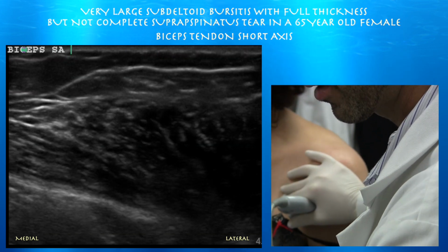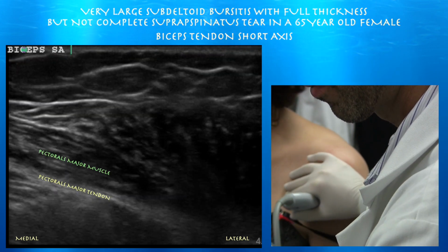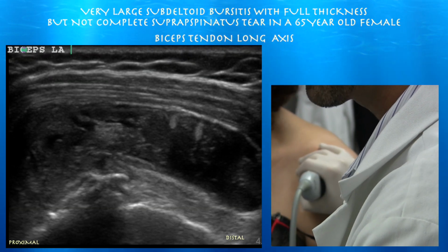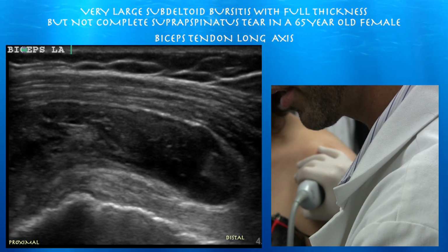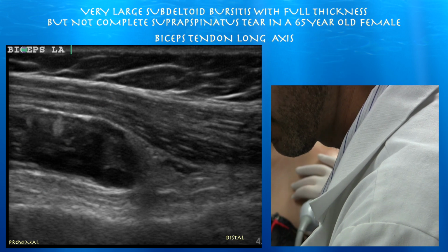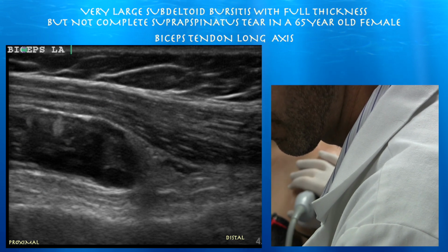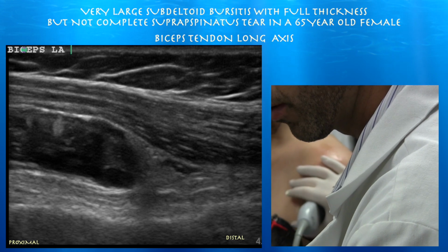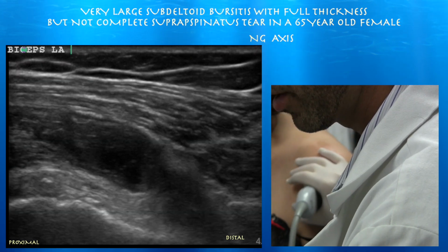We're going down to our pec tendon. There's the pectoralis major muscle/tendon unit. Here we are now, going long axis to the biceps tendon. Right side of the screen is distal. Again, here's that tremendous subdeltoid bursa right over the biceps tendon with some debris in it as well, between the biceps tendon and the deltoid muscle. She really just has a really large overhanging subdeltoid bursa.